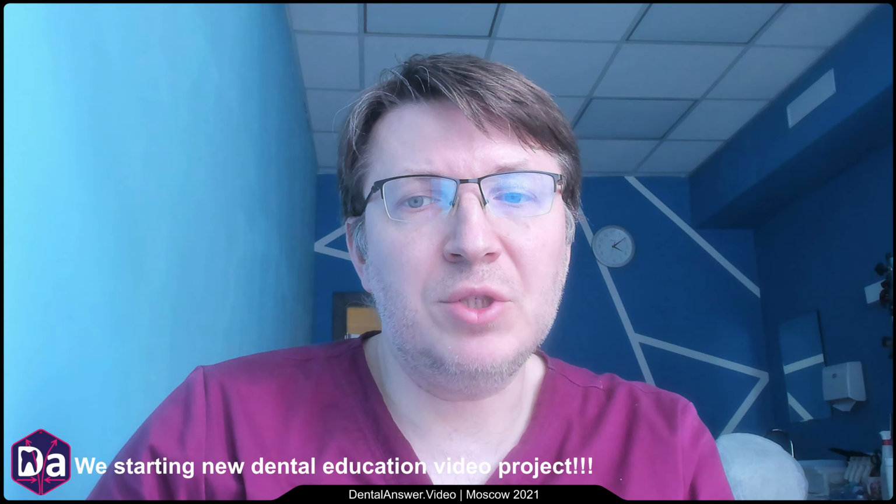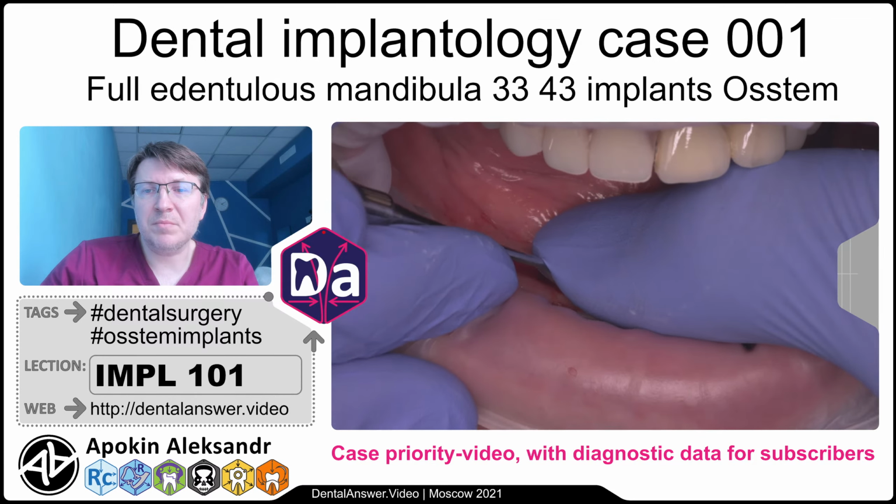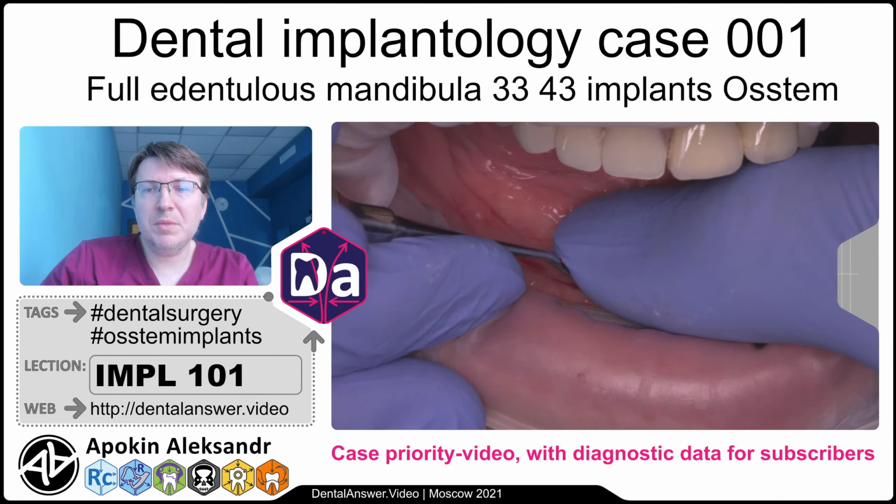With the blade 15, we make very small short incisions through all layers of the gingiva to the periosteum.